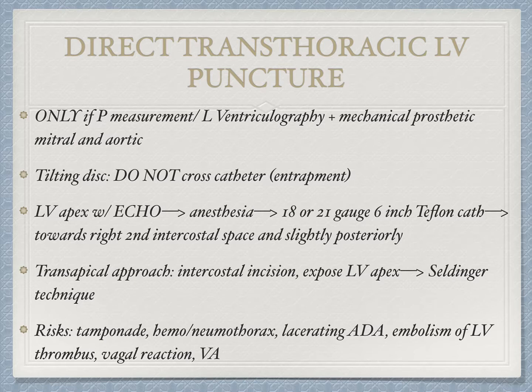You cannot avoid it when you need pressure measurement of the ventricle or ventriculography in the context of mechanical prosthetic mitral and aortic valves. Why? Because you cannot get to the ventricle any other way, and you do not want to pass a catheter across a mechanical valve, for example, tilting disc, where it can get entrapped.